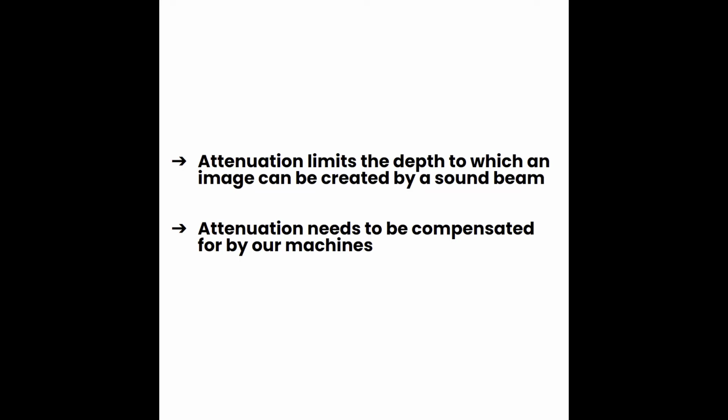As we work through this course, we're going to start to see how the knowledge of physics is going to help us to create better images. Two of the big things that you'll need to know as a sonographer is one, attenuation is going to limit the depth to which an image can be created by a sound beam.